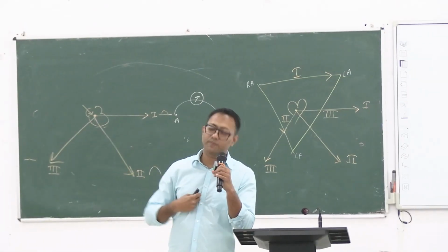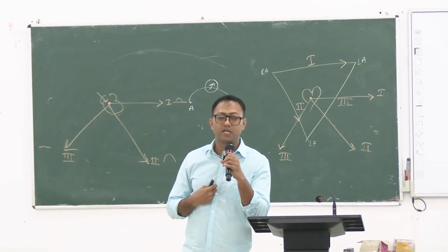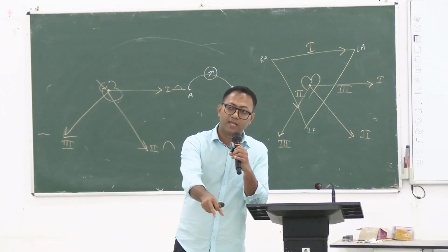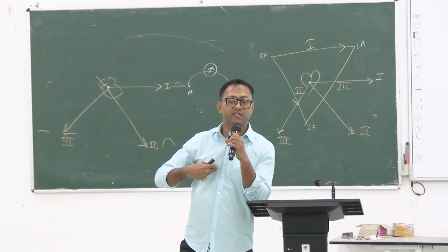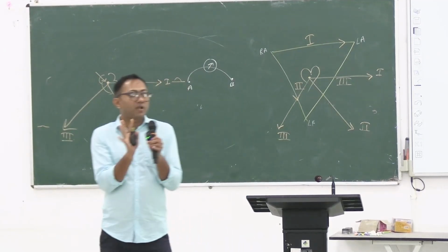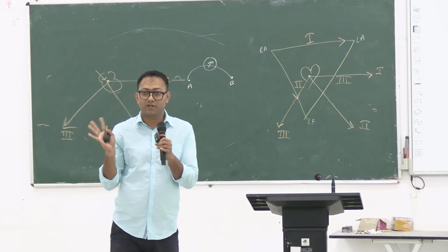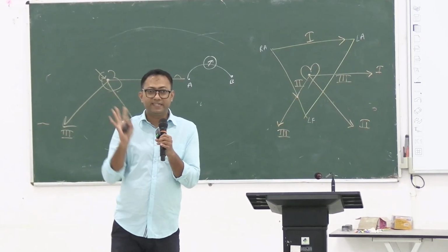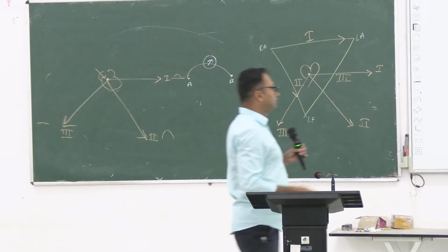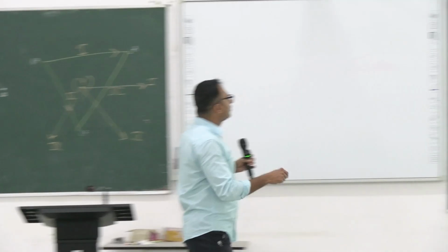Similarly V1 is also measuring potential difference between 2 points, one is zero potential within the ECG machine and the other is this point, the right fourth intercostal space. Clear? So this is why the name unipolar lead is a misnomer; nothing is unipolar lead, it must be bipolar. Okay, now come to augmented leads.